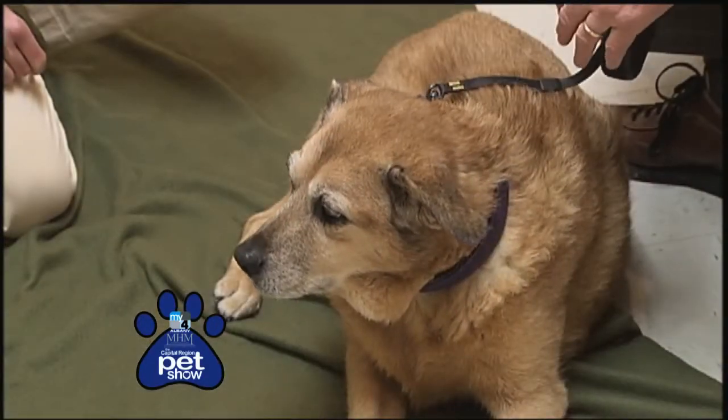Oh, that's very cool. And how long does the average procedure take? The average procedure can take as little as 2 or 3 minutes. Sometimes larger wounds or a much more inflamed area can maybe take even up to 4 to 6 minutes. And it's good for their hips and joints and everything else and helps their mobility and gets them up and moving. Absolutely. We've seen cats who had stopped jumping up on counters and now jump back up on the counters, which some of the owners are not as happy about, but it's great because those cats have regained their mobility.